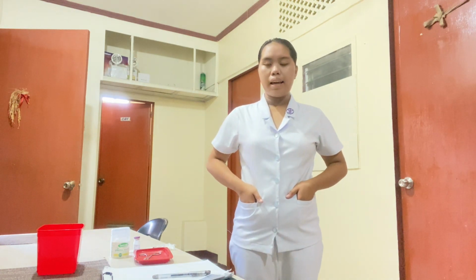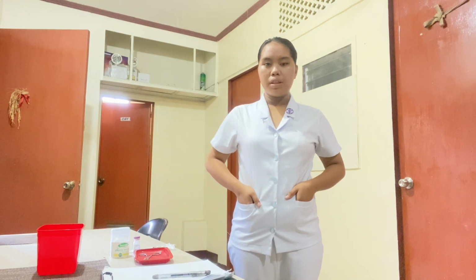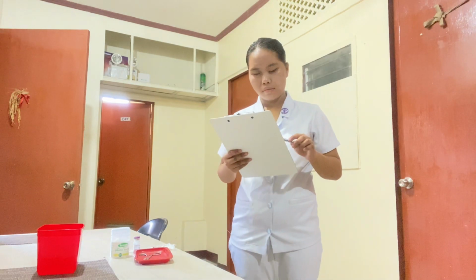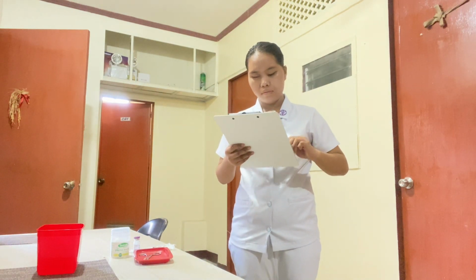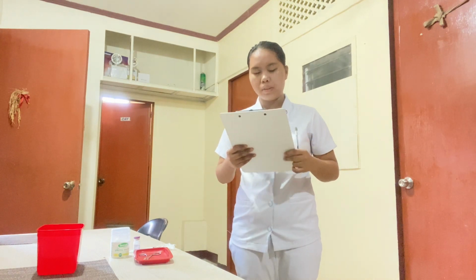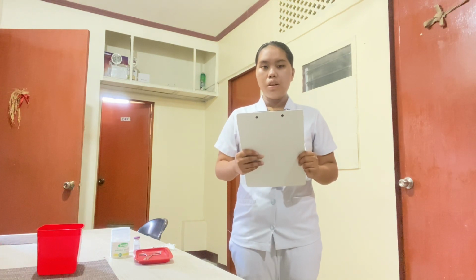Second, check the MAR, or the medication administration record. It is a legal record of the drugs administered to the patient. Next, check the medication against the MAR to make sure that the correct medication is being prepared.